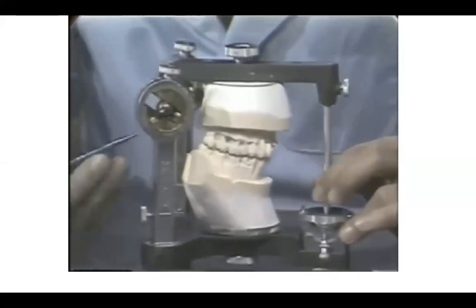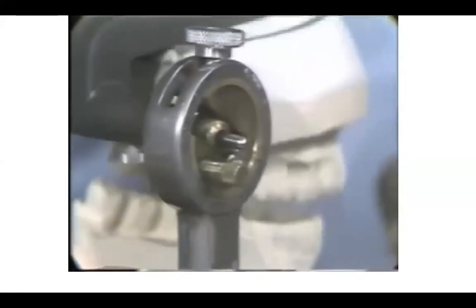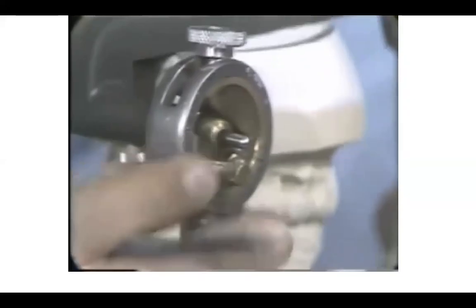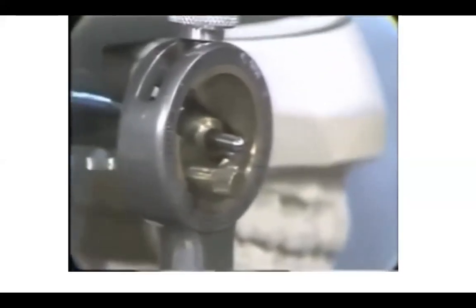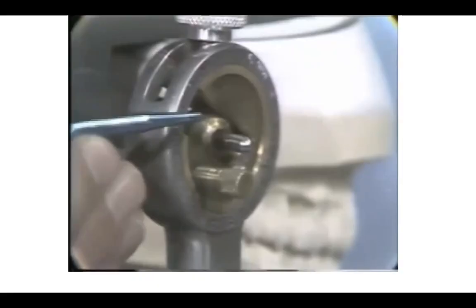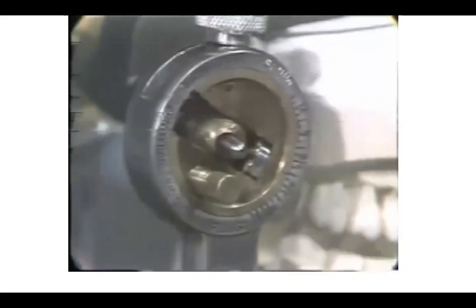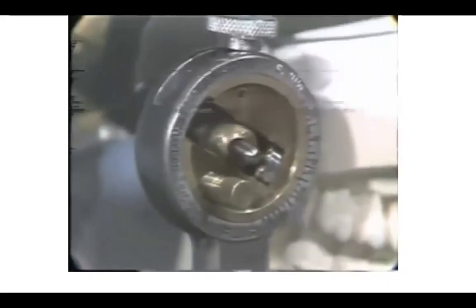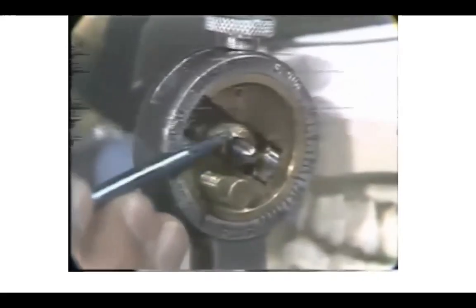If we look closely at the condylar element, we will see that the condylar axis is moving through a center ball. The ball is representative of the skull's condyle. Now, if we open and close, the transverse axis is rotating through the center of the condylar ball.